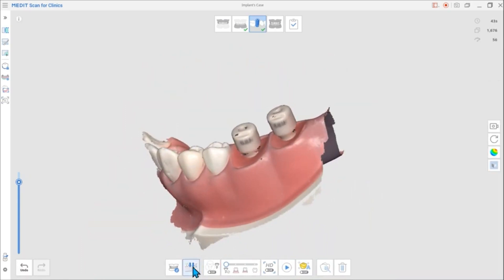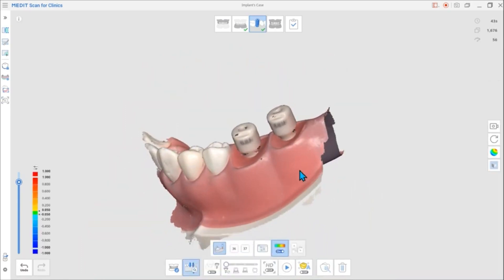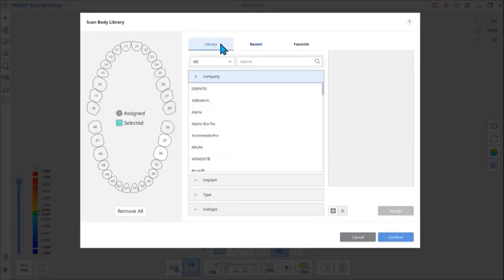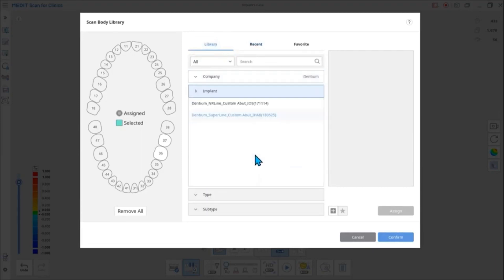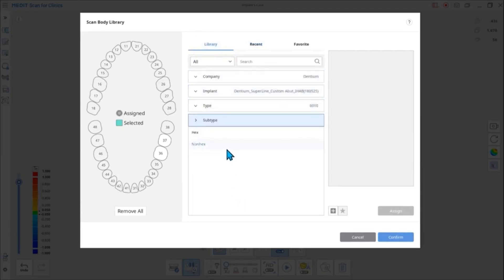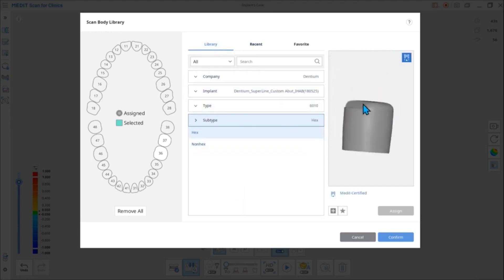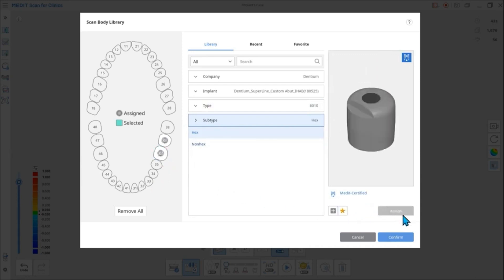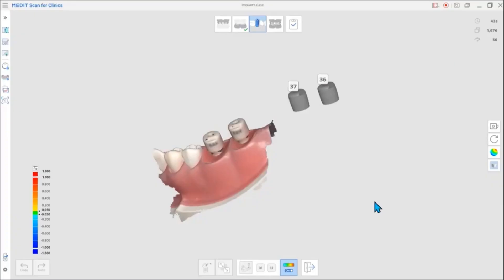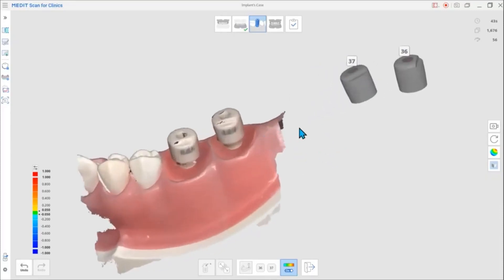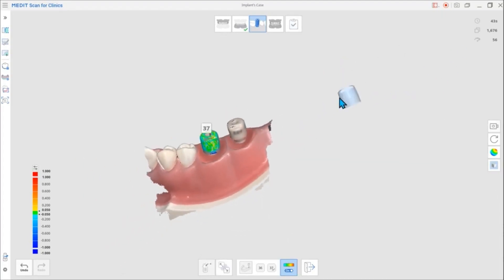Click the AI Scan Body Matching button at the bottom. Select the tooth and library you want to assign from the pop-up Scan Body Library dialog window. After assigning, click Confirm. This will close the dialog window and the library will appear on the scan screen. Assign one point or three points on both the scan data and corresponding library to match and align the two together.